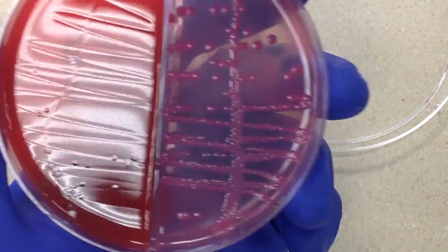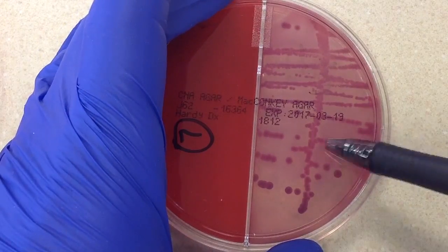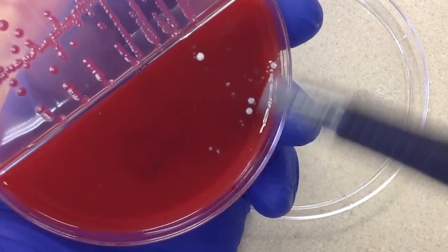This is kind of a tricky one because it's obvious that we have a lot of this gram-negative rod, and it looks like E. coli. But we also have some contamination here. So do we work it up or not?